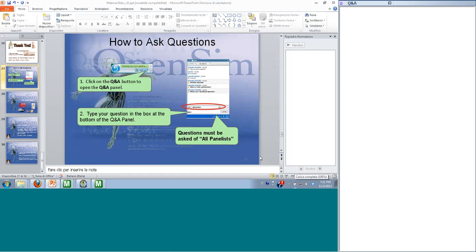Yeah, of course, it is a completely different process, because first of all, you need to have segmented surfaces of the anatomy of a specific subject. So you need to have accurate surfaces of both hard and soft tissue.